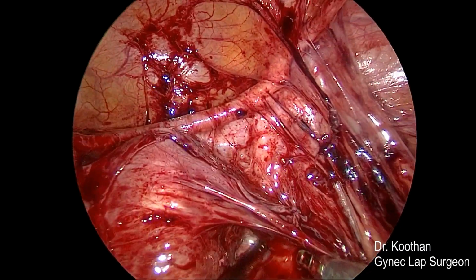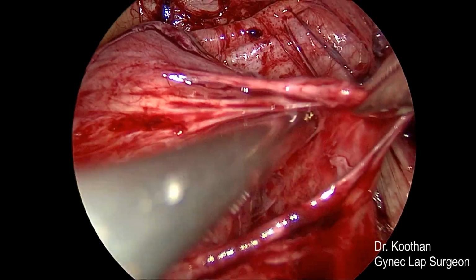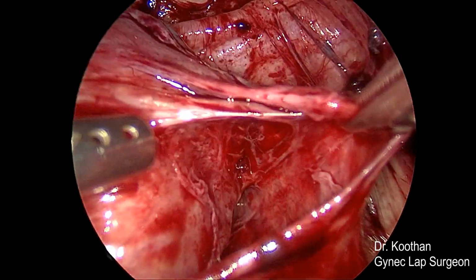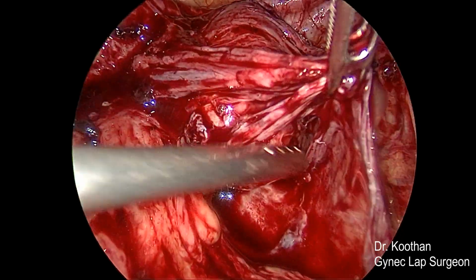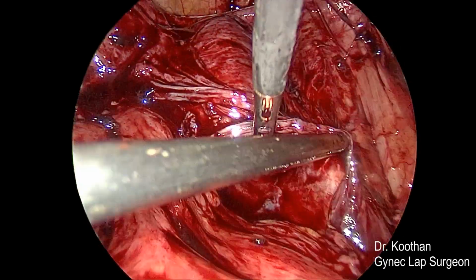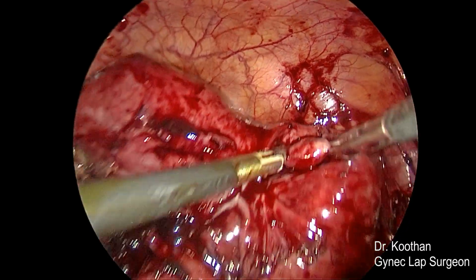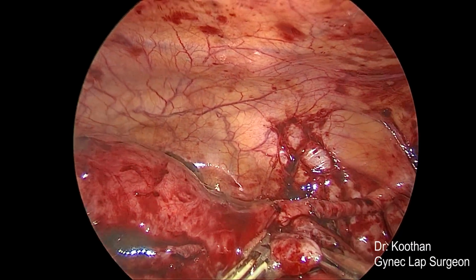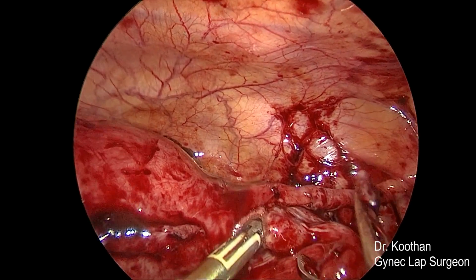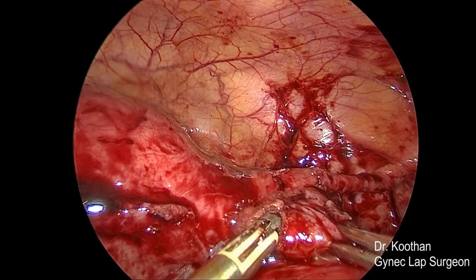You can see the round ligament on the right side, which is very taut and inflamed. This is the cornua, right cornua, and we are going to bisect the tube from the cornual attachment.